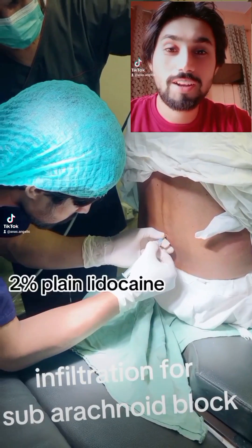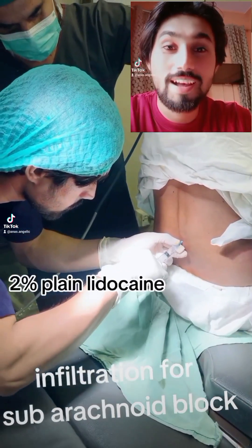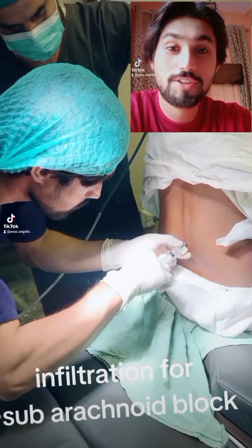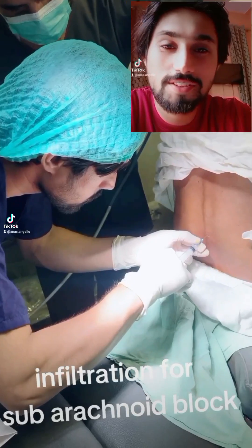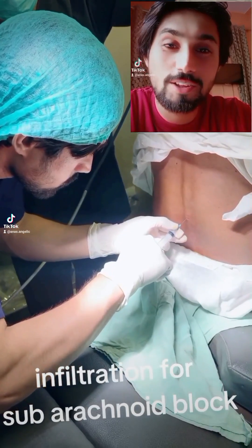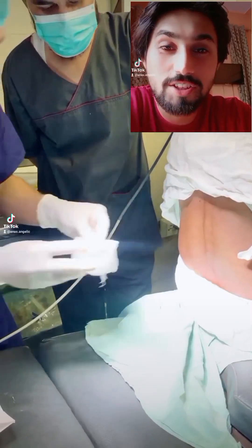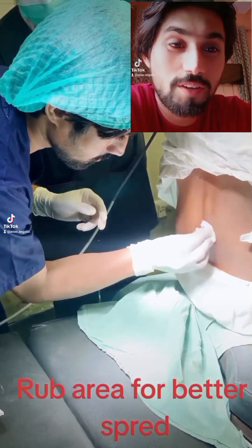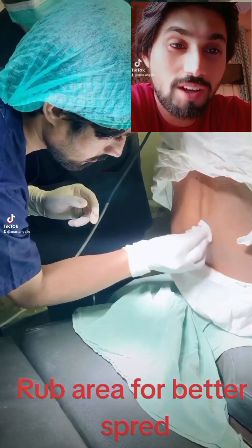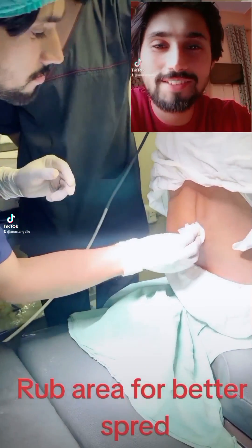Greeting to all of you. Here is a crash demonstration of spinal anesthesia. First, I give the local infiltration to the skin and deep tissue with 2% lidocaine for the subarachnoid block, then rub the area for better spread.